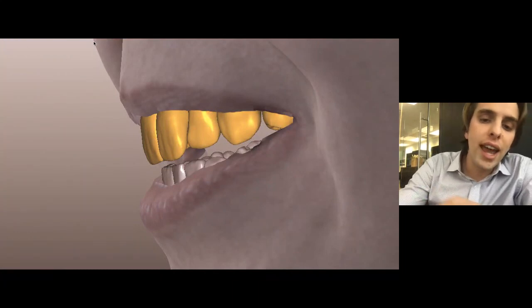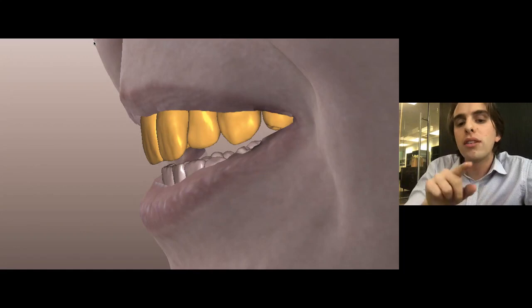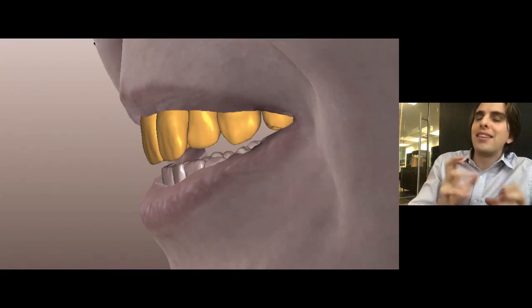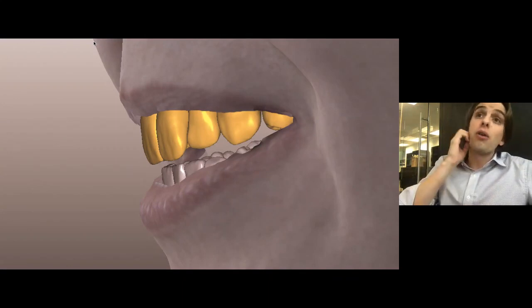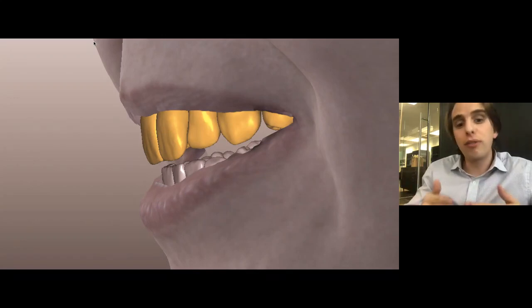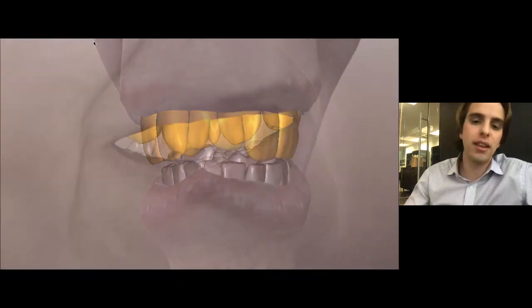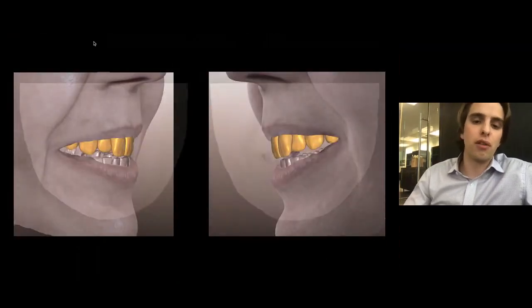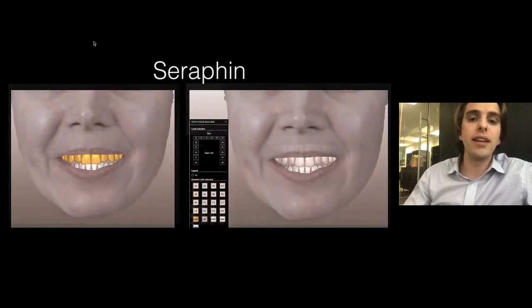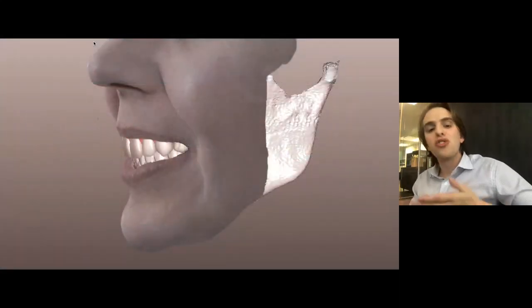We can start to understand what the triangle between the lateral and canine does to allow light into the smile. What does the little point on the incisal edge of the lateral do to really add these tiny aesthetic quirks that really make a prosthetic lifelike? What if we open the central incisors and give them a butterfly effect? We can see all of these things in real time and with a variety of different tooth morphologies in the various Vita shades.